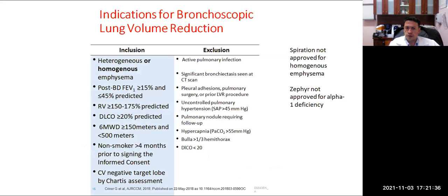So moving on to indications and patient selection, I think this is super important. And if anyone wants to take a screenshot of this, and you'll get the recording as well, and I can also send you these slides. But this is a cheat sheet on how to, when you're sitting in your office and you're seeing patients, remind yourself about this particular option for patients with COPD.